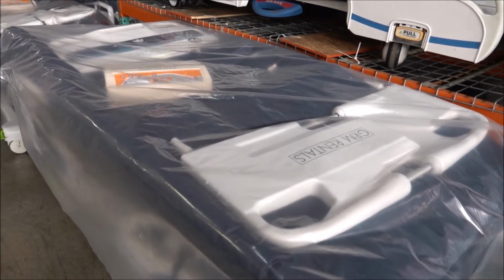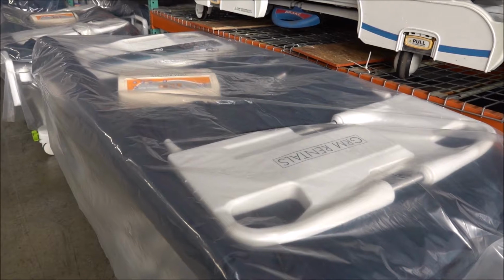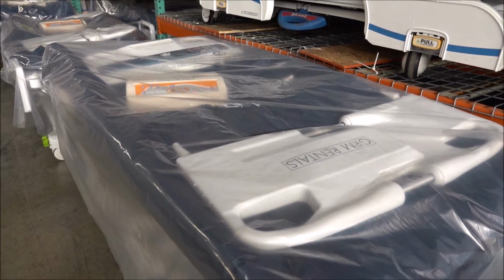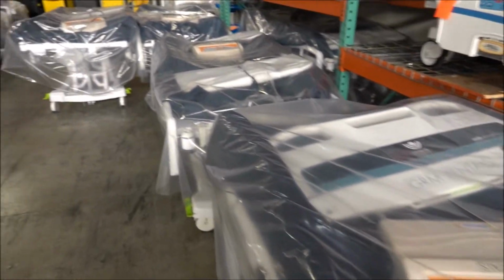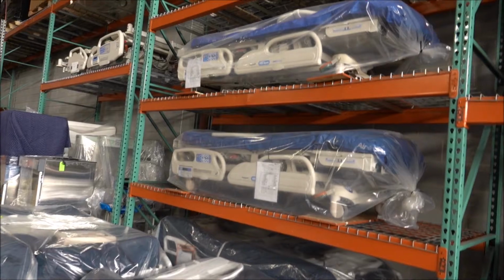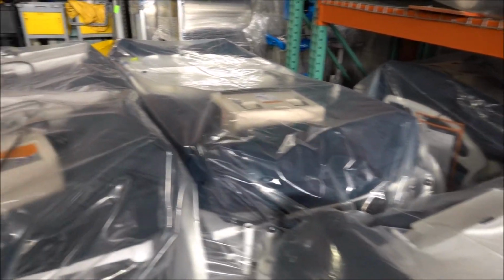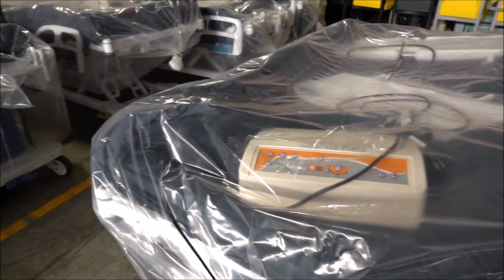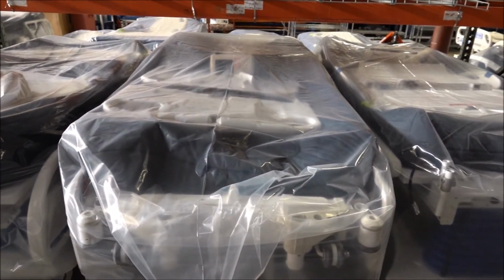Basically, low air loss is what it is: in the air baffles, you have little holes on the top that let air release from that baffle. That air runs over the surface of the bed, and that helps dry up bed sores and pressure wounds. So if it's a patient that's at risk of getting bed sores or they have them, when they run that multi-rhythm mattress system, it's an excellent mattress for that. And we do sell those just on their own, and we provide those a lot to hospitals and also to home care.